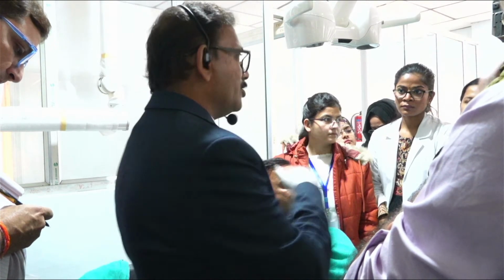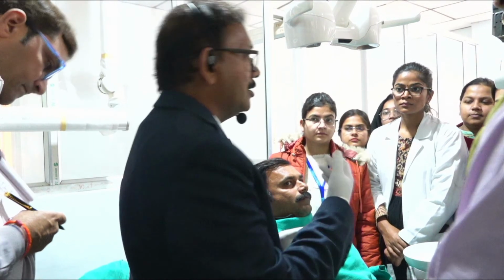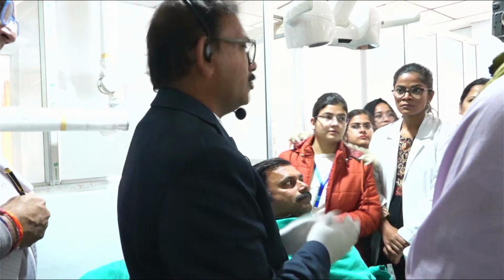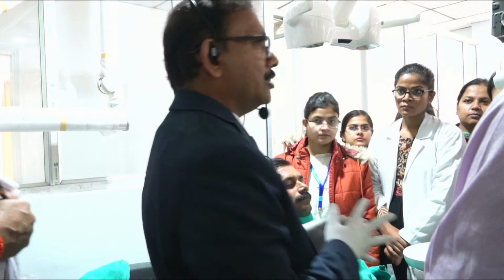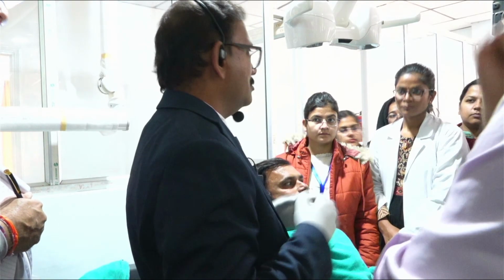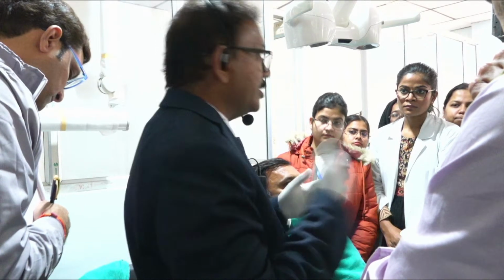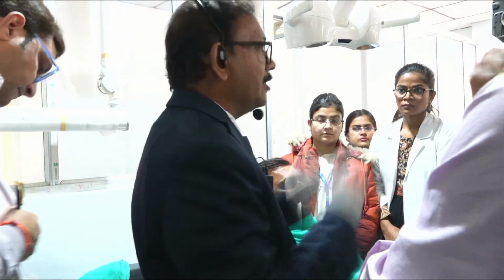Shade depends upon the shade of the patient. If there are more stains and more like initial fluorosis patients, the number of sessions will increase. Don't be very harsh on the teeth just to have that instant wow effect. If you tell the patient beforehand that it will take a little time and that you will go very smoothly on the teeth, they will understand.